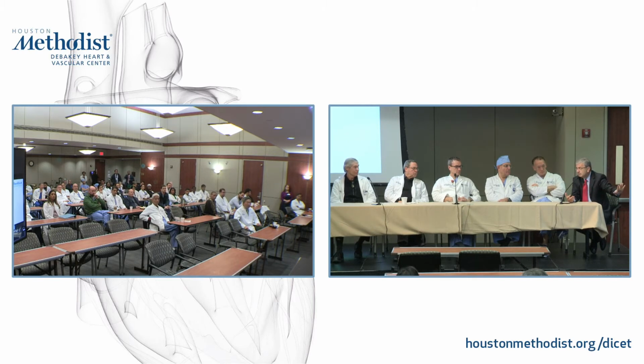But for the first scenario, a mechanical aortic prosthesis, if you're concerned about obstruction or a possible prosthesis-patient mismatch, or you're really not sure, the second step is a radiological one, and you can decide which radiological one to do. It sounds like a CT, even without the A, is important for you. If you want the A, angiography, you have to decide whether it's the right patient to do it. But it is not a transesophageal echocardiogram.